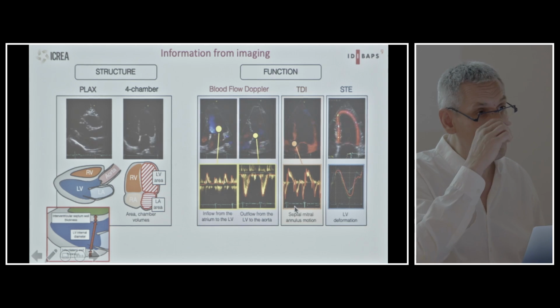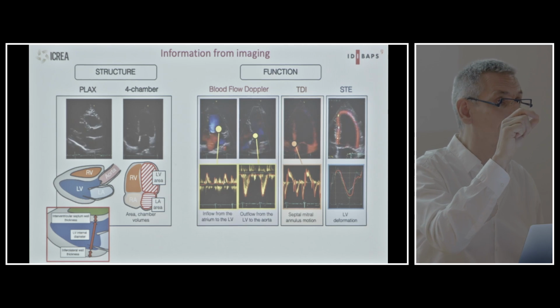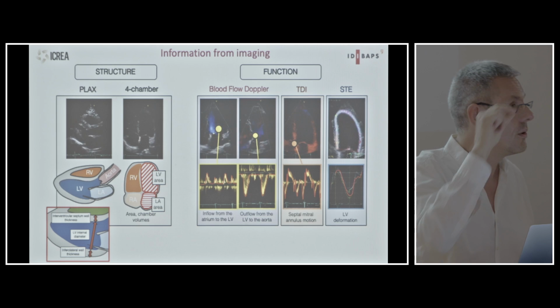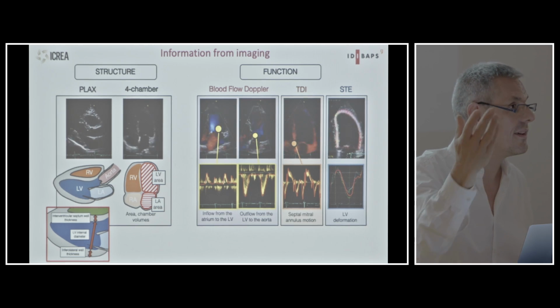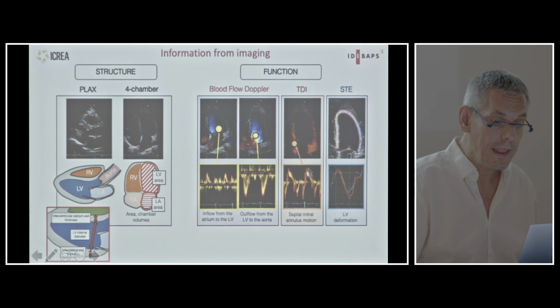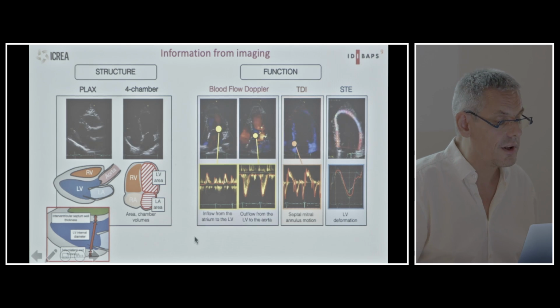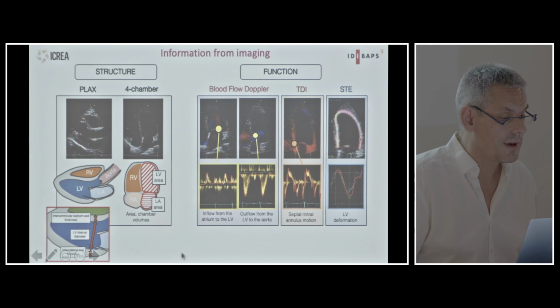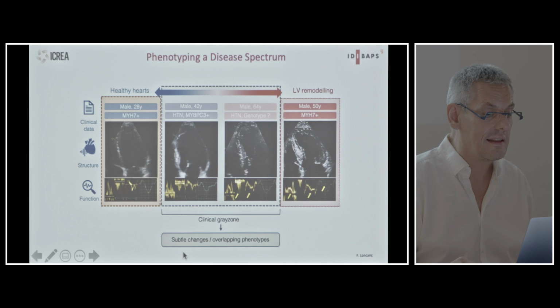It was already shown this morning by Dr. Mele, saying that in the guidelines, some people are saying, don't only look at the measurement of strain, for example, but look at the strain patterns. And you will see that I will keep on coming back there, and even later on in artificial intelligence, this will be very, very important. And we will see actually that using the deformation curve, potentially together with all the other information, is really important to discriminate, because very often with just the measurements of the geometry, we will not get there.